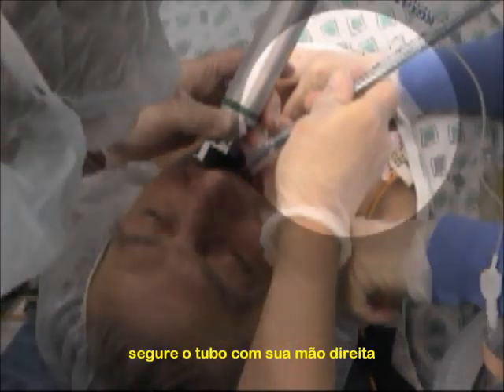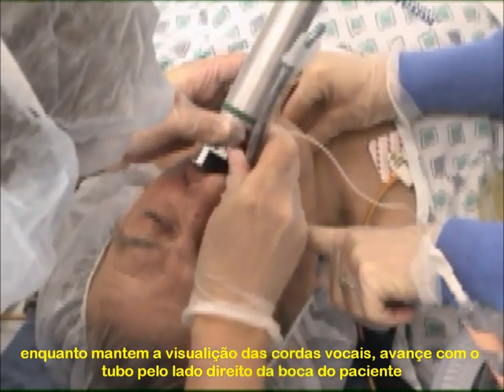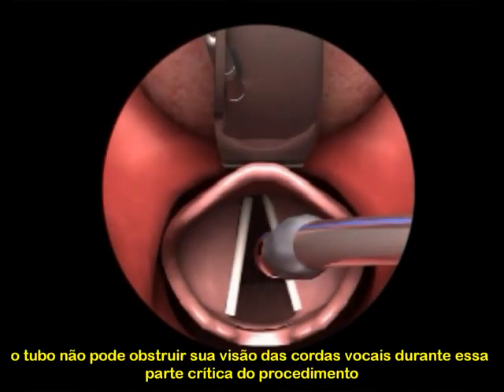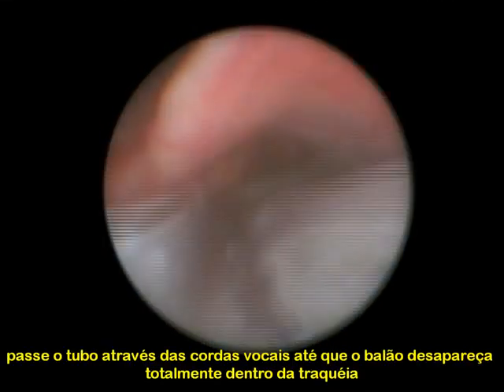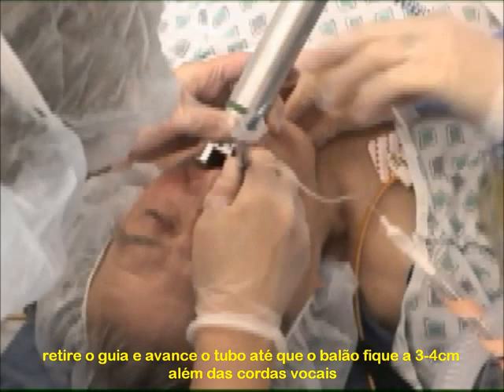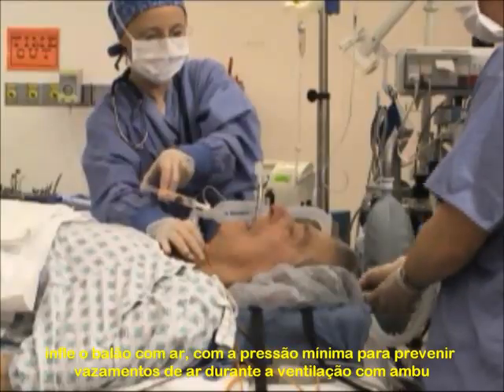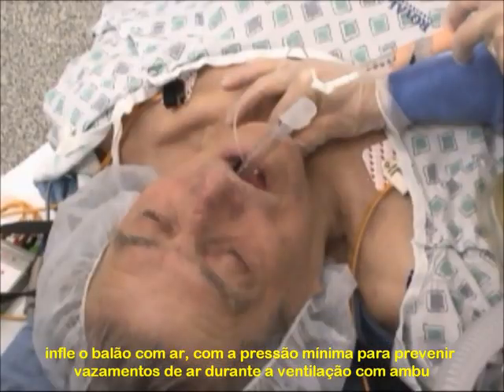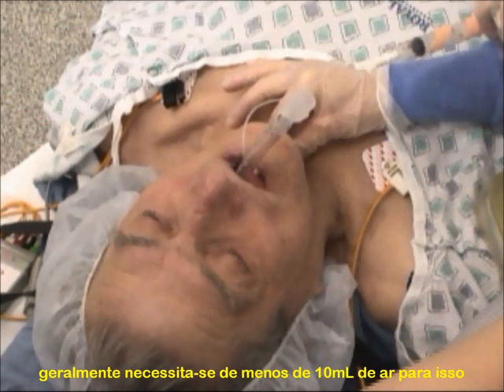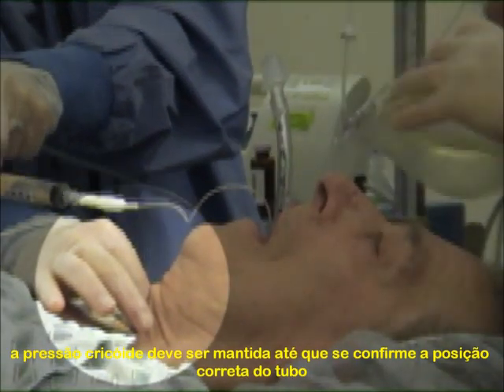Hold the endotracheal tube in your right hand. While maintaining your view of the vocal cords, insert the endotracheal tube into the right side of the patient's mouth. The tube should not obstruct your view of the vocal cords during this critical part of the procedure. Pass the tube through the vocal cords until the balloon disappears into the trachea. Remove the stylet and advance the tube until the balloon is three to four centimeters beyond the vocal cords. Inflate the endotracheal balloon with air to the minimum pressure required to prevent air leaks during tidal volume ventilation with a bag. This usually requires less than 10 cc's of air. The assistant must maintain cricoid pressure until tube placement in the trachea is confirmed.